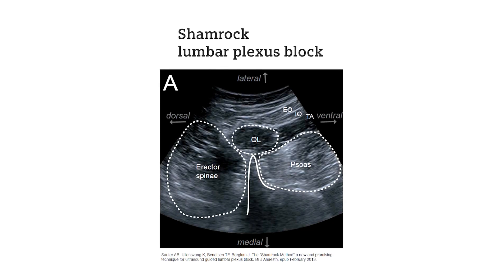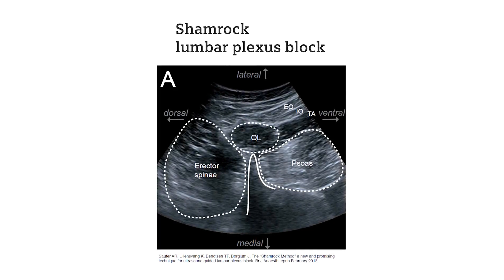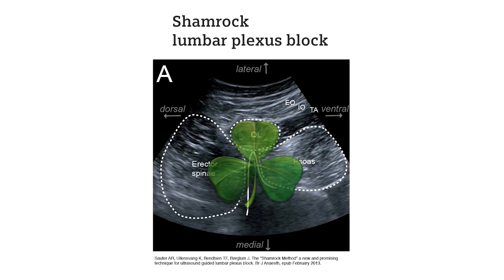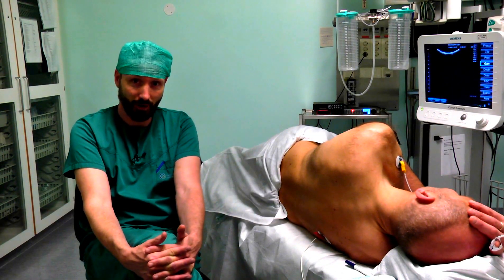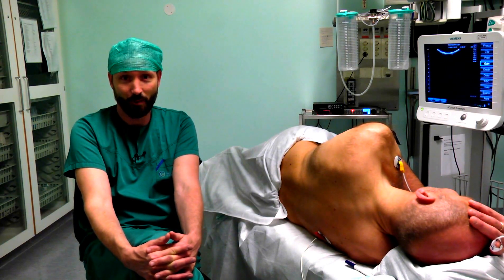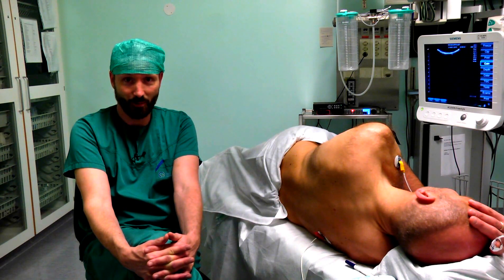We have developed our own ultrasound guided lumbar plexus technique. We call it the shamrock technique, and it is quite similar to classical techniques for lumbar plexus blocks with posterior-anterior needle advancements. However, what is special is that we use ultrasound scanning in a transverse plane and that we identify the pattern of a shamrock when scanning the patient.